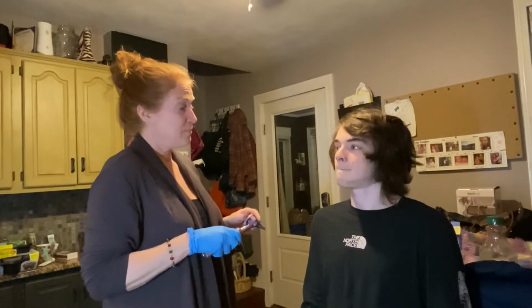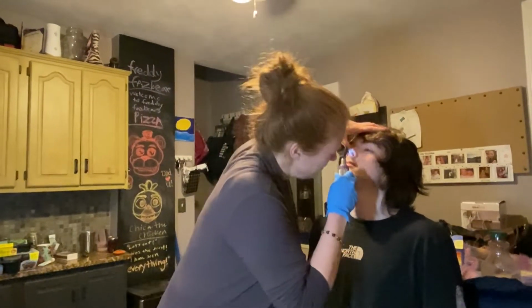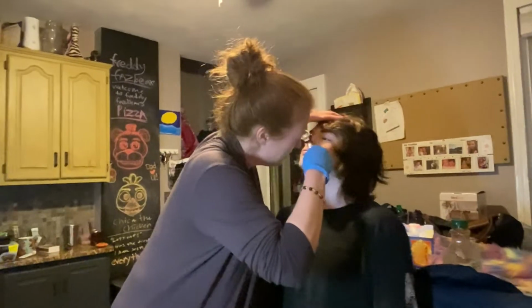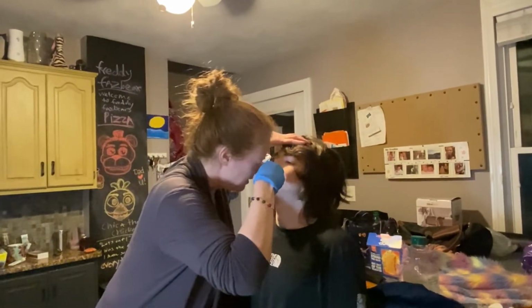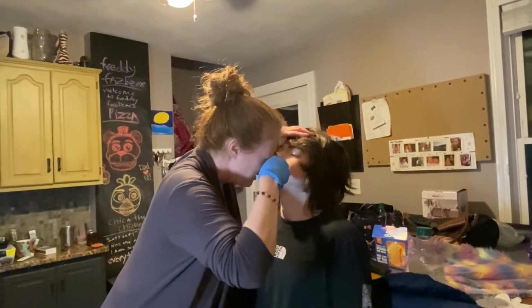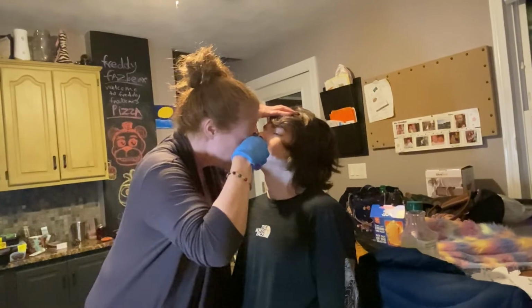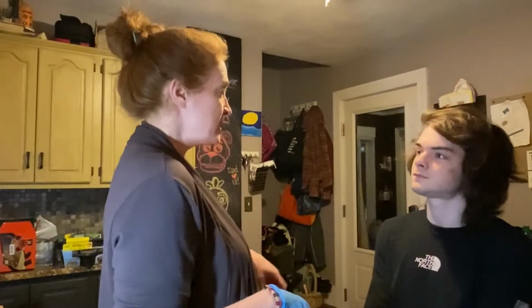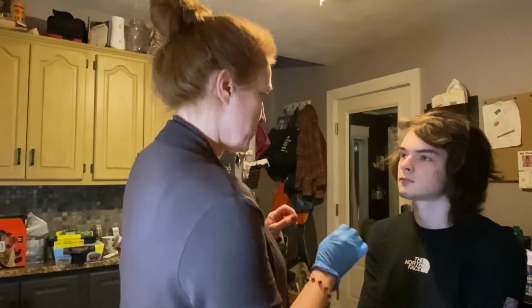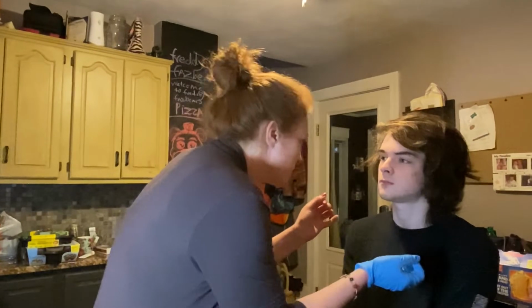I'm going to do the same now to the other side. Again, I'm going to hold up your nose, fit it inside, tilt downward, and same. Turbinates are normal. No drainage. Septum appears normal. Next, we're going to inspect your mouth. Your lips are symmetrical. They're moist and pink. No cracking, scaling, no lesions noted.